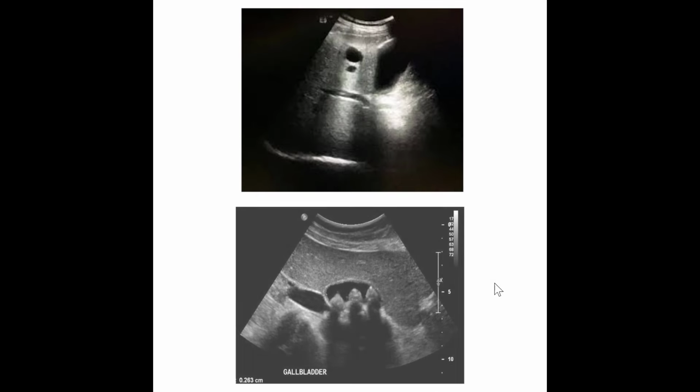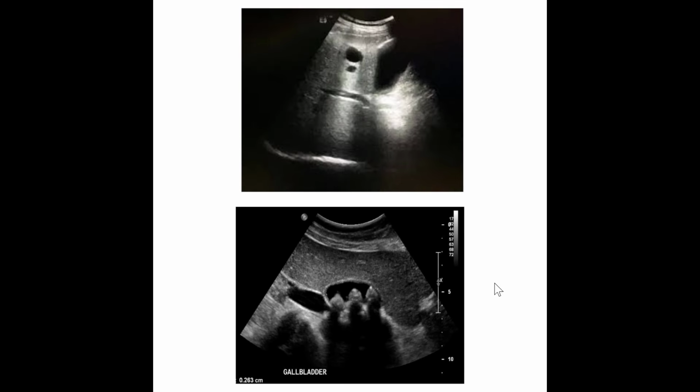Compare that to where there was regular parenchyma traveling through and attenuating. We see that we have very dark, weak echoes returning from our far field. Contrary to that, then, we have items that can absorb a lot of sound energy and leave none for behind it. So when sound is coming into these structures here, these are gallstones, they're absorbing all that sound energy and there's nothing left to image behind. This is where we get shadowing from.